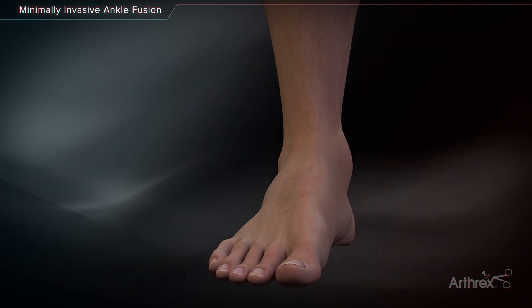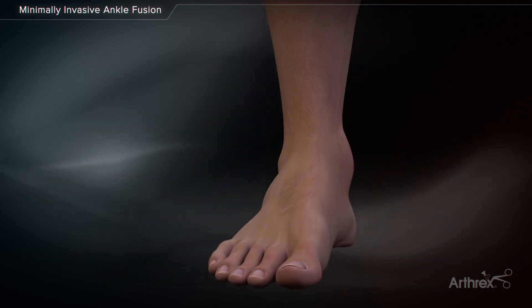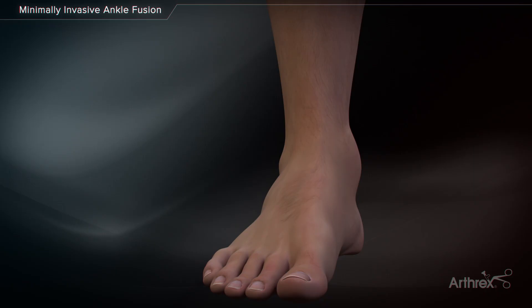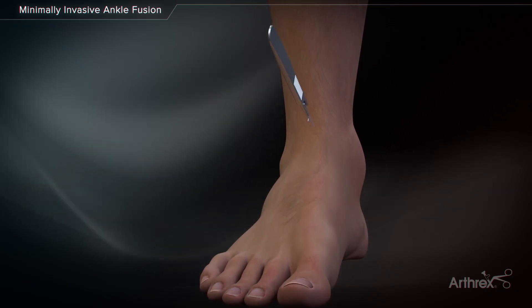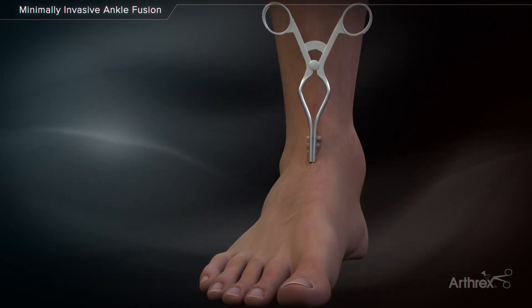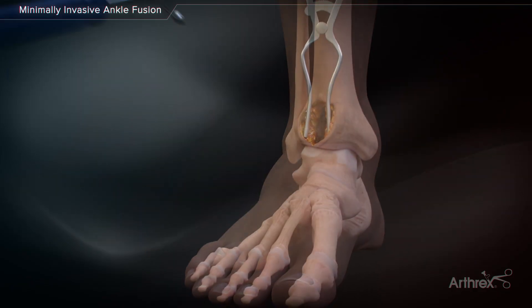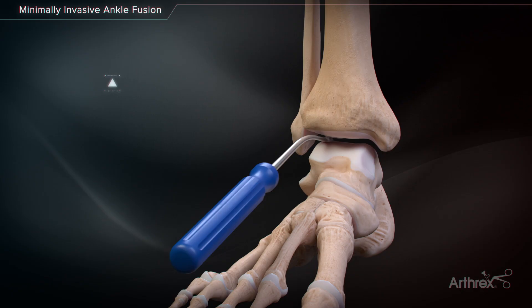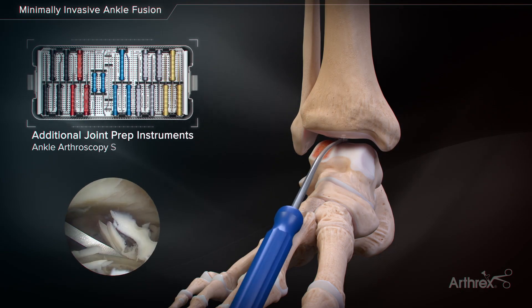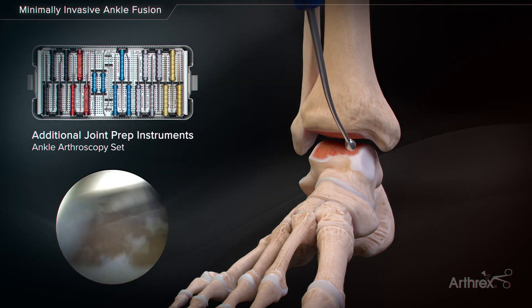Arthrex presents a mini-open approach to anterior tibiotalar arthrodesis utilizing the minimally invasive ankle fusion plate and compression FT screws. Extend the medial portal of an arthroscopic approach to allow placement of the minimally invasive ankle fusion plate. Remove cartilage from the ankle joint using a curette or osteotome. This can be performed open or arthroscopically prior to making the anterior incision.